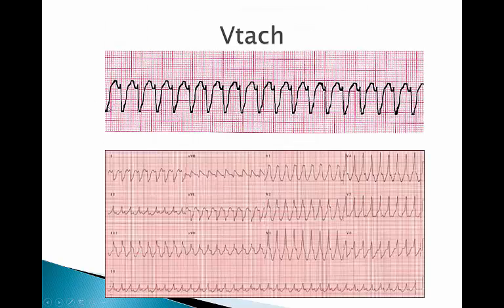All right, here's another strip. Here is a 12-lead ECG, and that's just ugly. You don't want to see that.